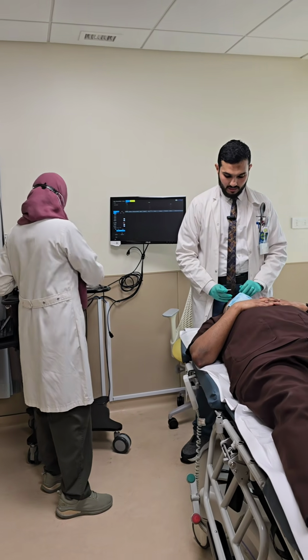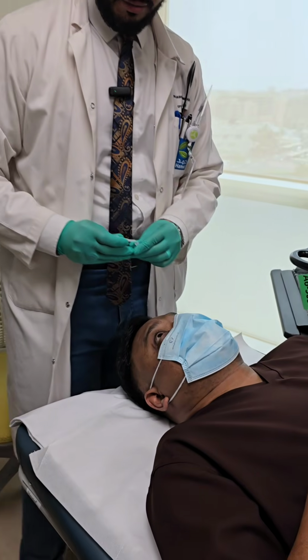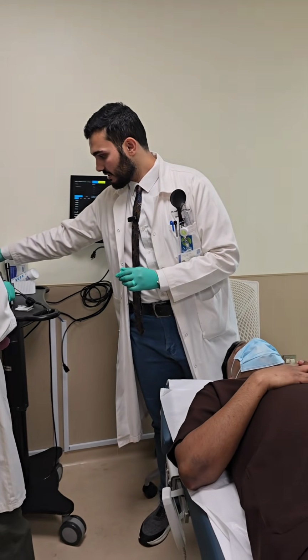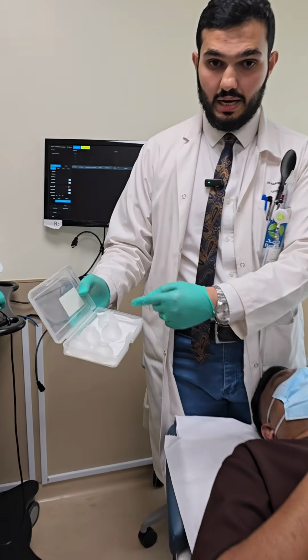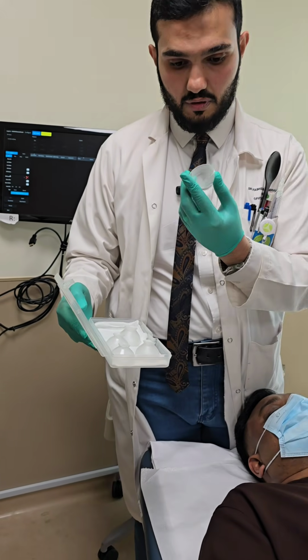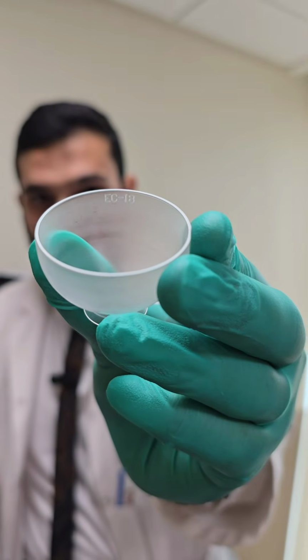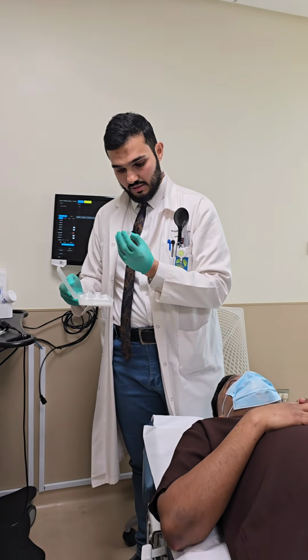We'll do, for example, the right eye of the patient. We'll put just one drop of anesthetic. Always be sure that you are using gloves. Here you can see we have the scleral shells, the eye cups, of different sizes. If you come here, you can see the size of the scleral shell. It's 18 here. Usually we select 20 or 22, depending on the eye size of the patient.